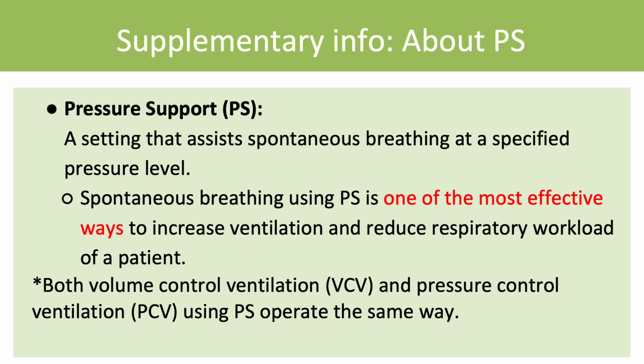Understanding PS may be confusing as it is described along with the modes and methods of ventilation, but you can remember the term as one of the settings such as inspiratory pressure and ventilation frequency.